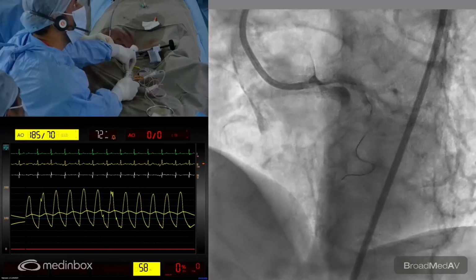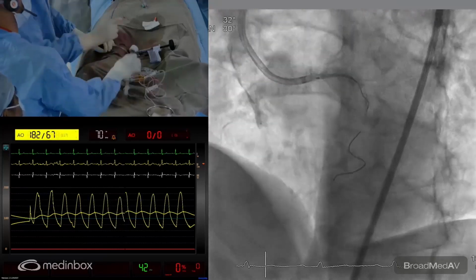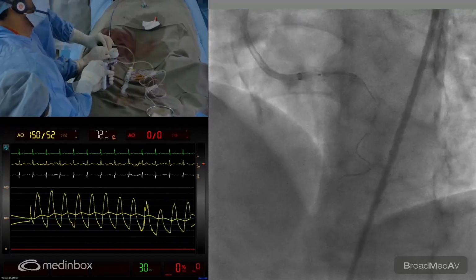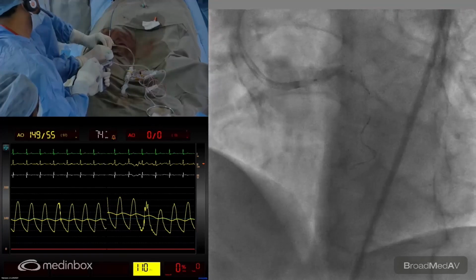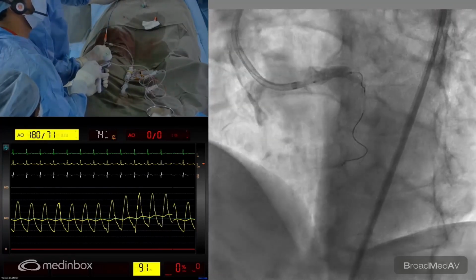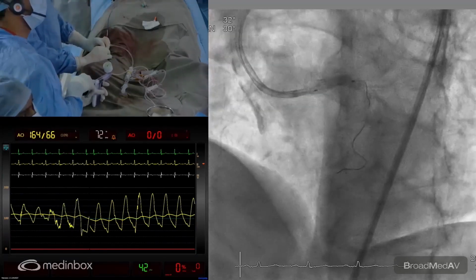Let's take one cine here. As you know, the stent arises outside the marker. That's good, I think. Exactly there. What do you think? Okay. That's perfect. Okay, let's go up there now. Go up slowly. 2, 4, 5, 6, 7, 8, 9, 10, 11. Nominal at 12. 12. Deflate.